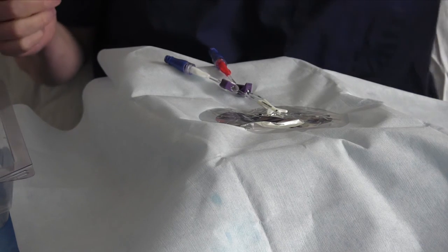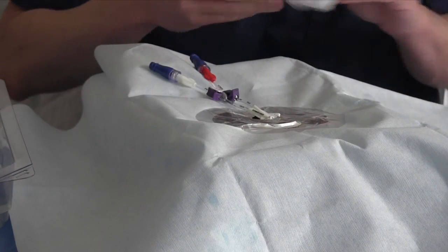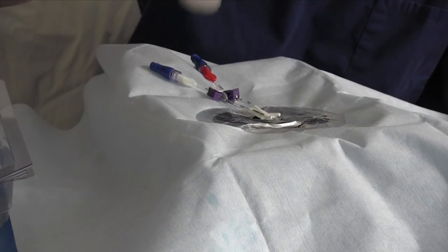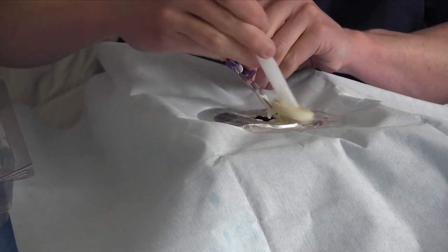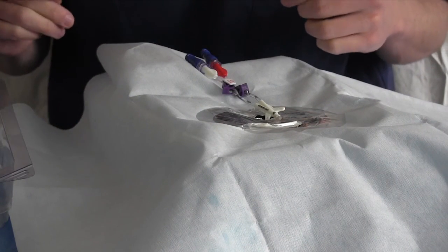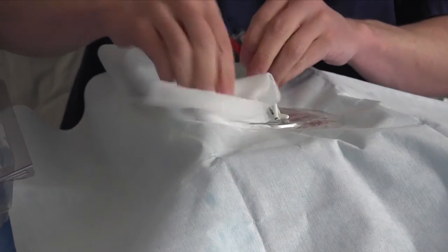First thing I do is I grab a whole bunch of 4x4s, get rid of all the blood, make this site nice and clean. I'll take a second ChloraPrep stick, wipe the entire site. Blood is a nidus for infection. Get rid of all that blood. Okay, now dry the site again.